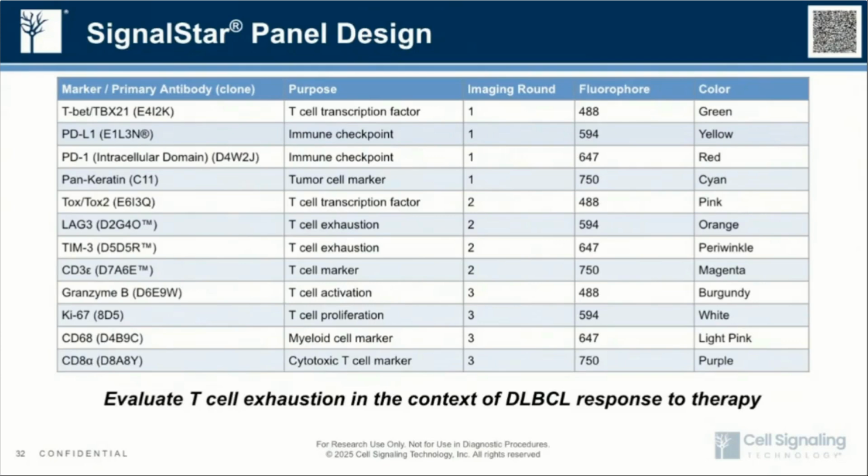And then in the first imaging round, you would apply specific complementary oligos to the first 4 antibodies you see at the top of this table. In the second, remove those after imaging and apply the second round of oligos, remove those, apply the third round of oligos. There's no concern that by the third round you are worried about epitope degradation or tissue moving or anything like that, because the antibodies are already bound at the beginning of the assay.